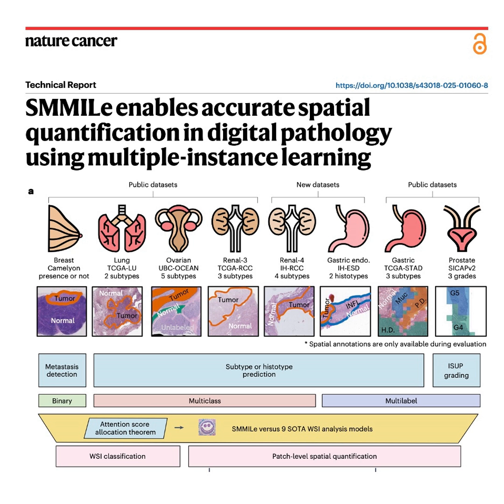They isolated what they called contentious patches. These were microscopic areas where SMMILe strongly disagreed with the human annotator and where all the other AI models had failed. Literal showdown. Exactly. They essentially set up a showdown, bringing these specific patches to a senior expert pathologist to adjudicate who is right, the original human or SMMILe. Let's look at the lung cancer case first. It's like a microscopic detective story.